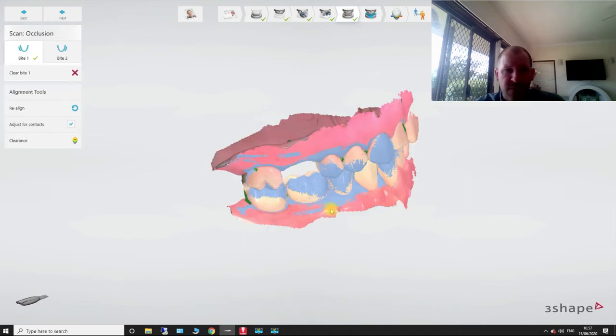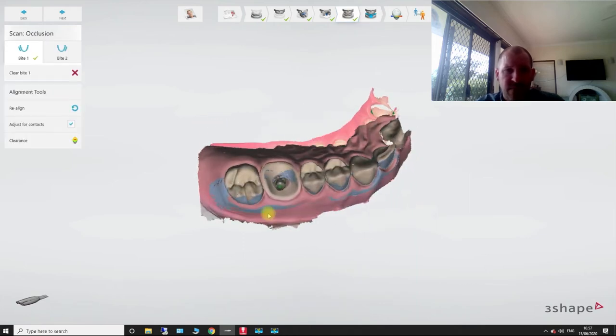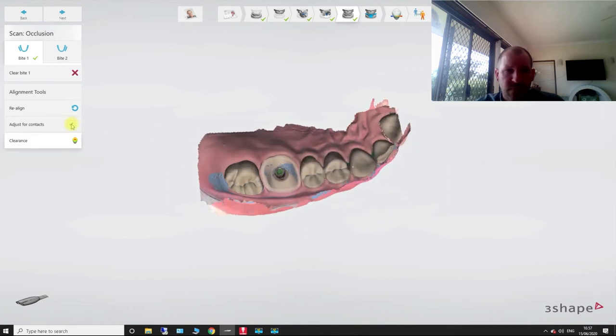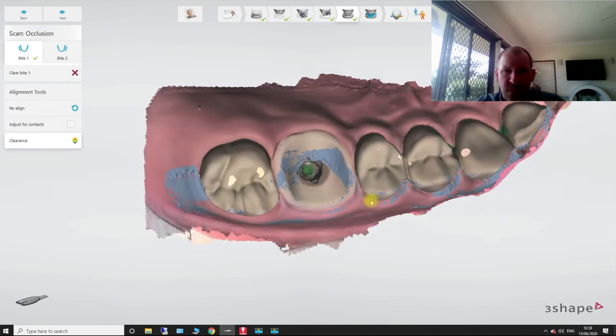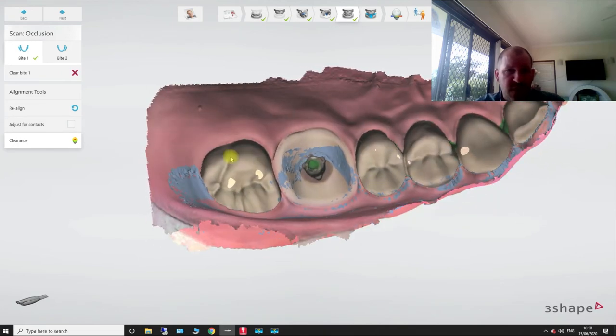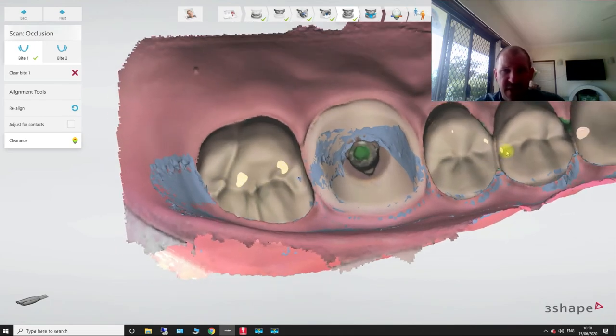I'm not going to do the live bite here. So there you go. So now that I've ticked this, adjust for contact, you can see our contacts are a lot heavier. Here, here, here, here.